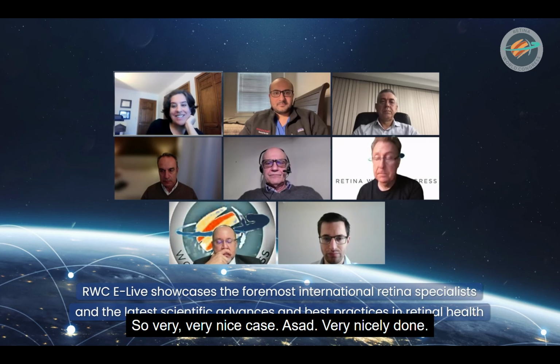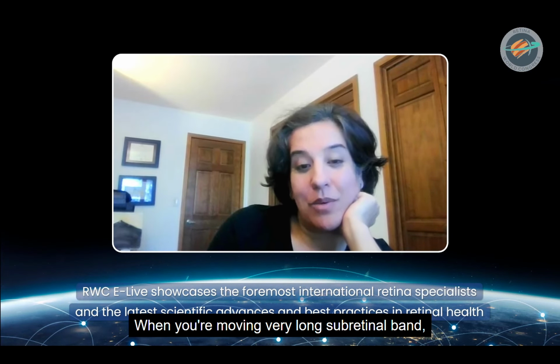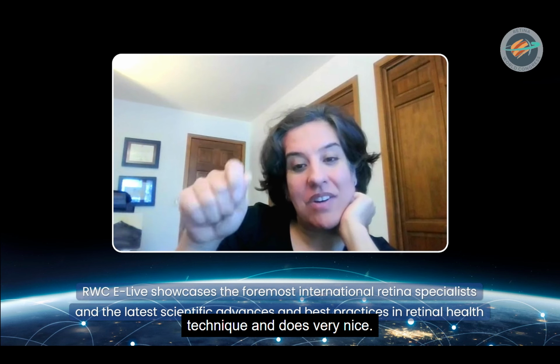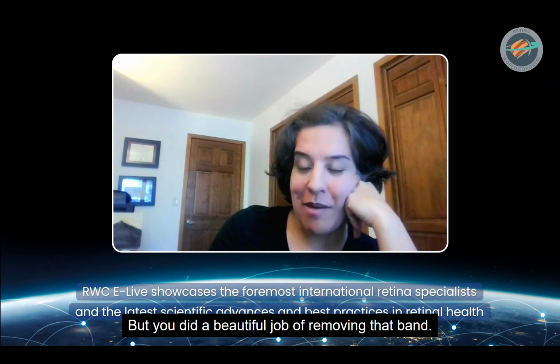So very, very nice case, Assad. Very nicely done. I had mentioned to him that there was a technique Dr. Ted Lang actually presented at the Vit Buckle Society. When you're removing very long subretinal bands, you can use a spaghetti twisting technique, and it does very nicely. Then you don't stretch out that hole. There's much less movement of the eye, but you did a beautiful job of removing that band.